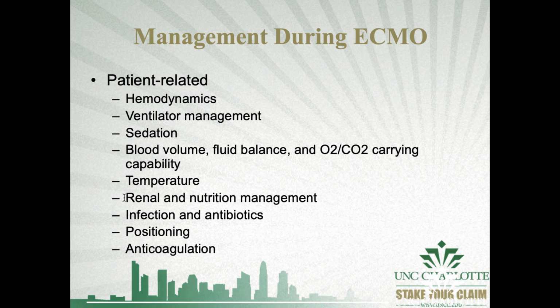You can prone a patient on ECMO, but mostly this is very important with little babies. I've had to actually sit there with a baby on my hand for hours on end just to get things right with this cannula and get things situated, because the pump kept cutting off. But with adults as well, neck positioning will have a major effect on sometimes the flow. But you also have to look at other parameters such as their fluid status if you're having such a serious effect on the patient's positioning with your return flow or your pump characteristics.